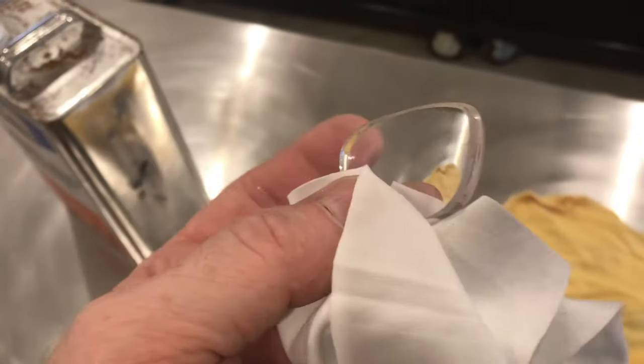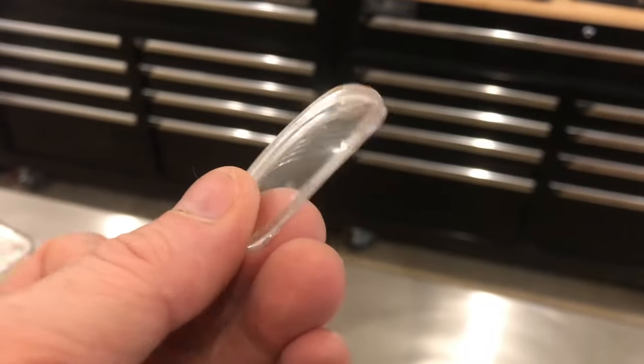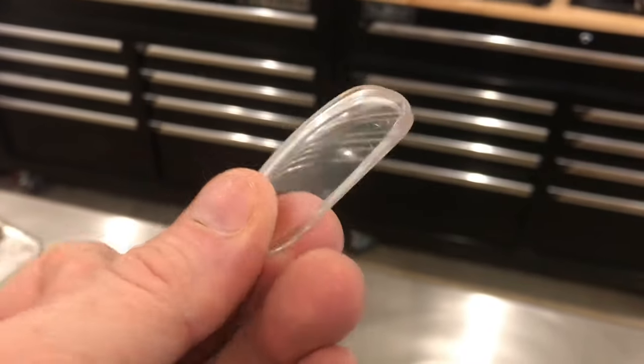So far I've just sprayed the lenses. If you soak it, it'll make it a little bit easier. With just the rubbing alcohol and the fingernails, you can see that the coating is almost completely removed.